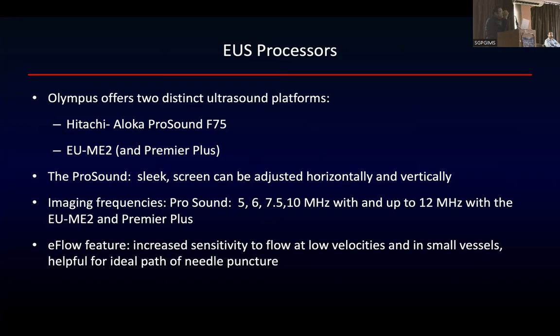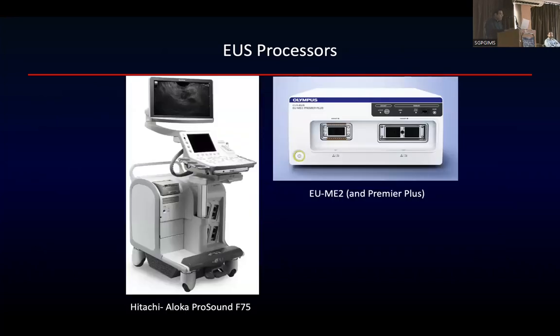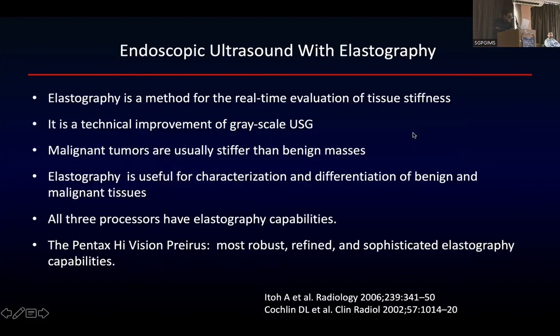So why? Because when you're puncturing or doing an FNA or an FNB, one of the major concerns that you have is bleeding. And if you are able to detect small vessels with some imaging feature, that really makes a difference. You can apply Doppler, which you obviously do before you puncture, and you know that there is a vessel around. You need not go through the vessel or choose a separate path. So this is what the machine looks like. This ME2 we have with us.